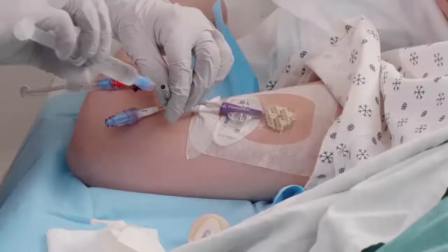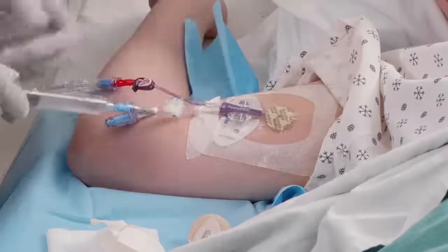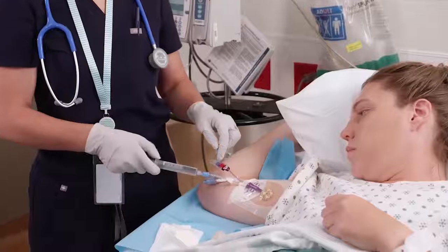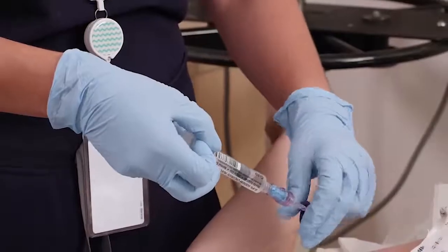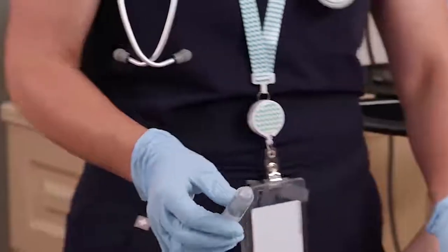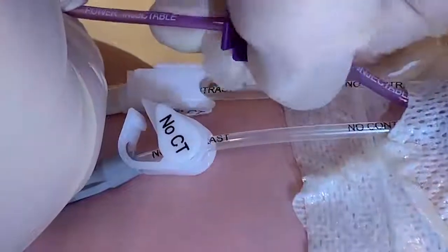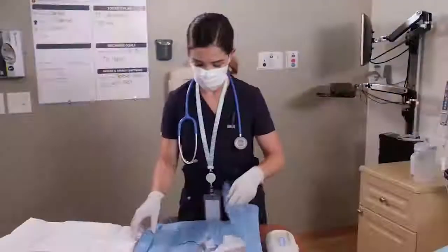Apply new needle-free connector with attached saline syringe, and flush the catheter per your facility policy and procedure, utilizing the manufacturer-recommended push-pause flushing technique. If the catheter will not be immediately used for infusion, be sure to clamp the extension leg to reduce risk of blood reflux or air emboli.